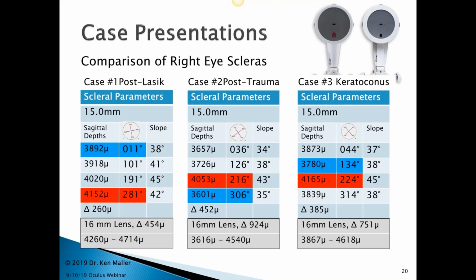The other thing not to forget is that the acquisition time, getting the patient set up, getting them to keep their eye open, is not necessarily a trivial matter for the patient, and tear films do start to break up, and you're sitting there trying to get everything lined up. That can be problematic. That is the one thing that I don't really worry about getting the Pentacam data, because it's not reliant on the tear film whatsoever. So that is a glaring difference between the two.